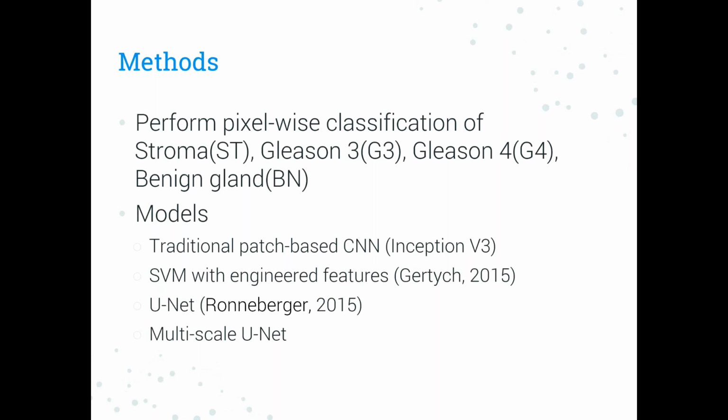So our methods were to perform pixel-wise classification of stroma, Gleason 3, Gleason 4, and benign glands. We used several models. We used a patch-based CNN. We used an SVM with engineered features. We used a U-Net, and then we created a multiscale U-Net.